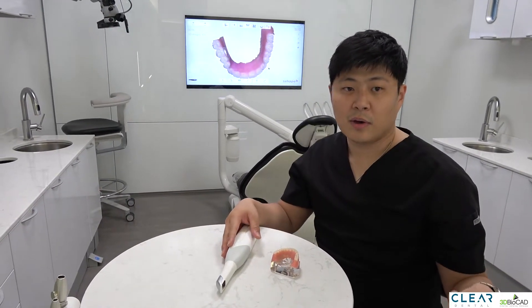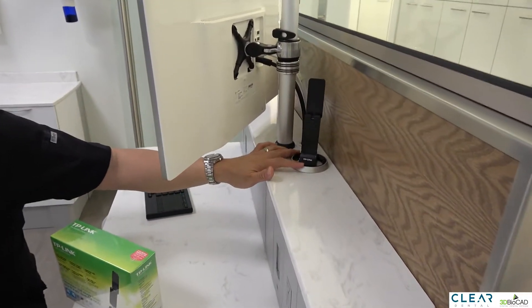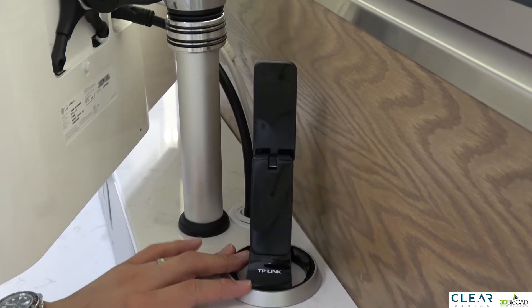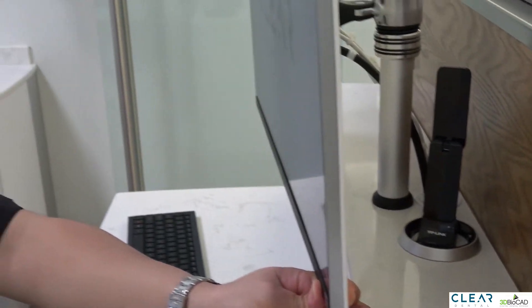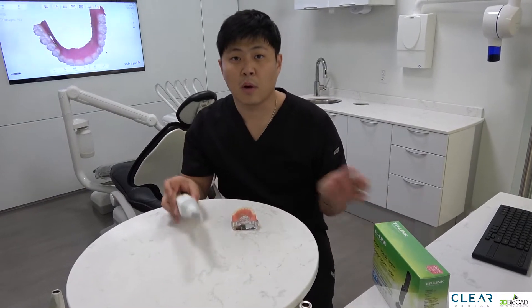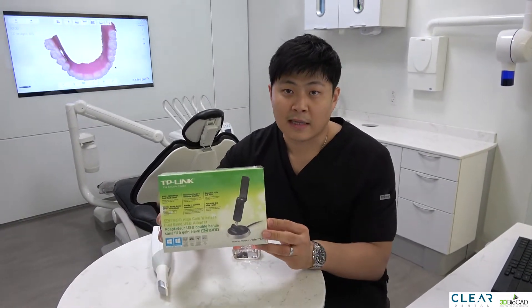Now let me show you how we have our TRIOS connected to our computer. If you look at the monitor behind me, there's a Wi-Fi adapter that comes with the TRIOS scanner. This is connected to the computer. If you have multiple operatories and multiple computers and you want the wireless TRIOS to connect to each one of them, you can buy this wireless adapter.